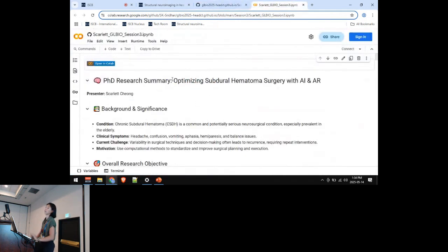You don't have to download anything. You can just follow along. The first 5 minutes will be my introduction, and the next half will be hands-on coding. You don't have to write any code. You just have to hit the play button together and see results. And then you can keep the code if you want for reproducibility for future use.